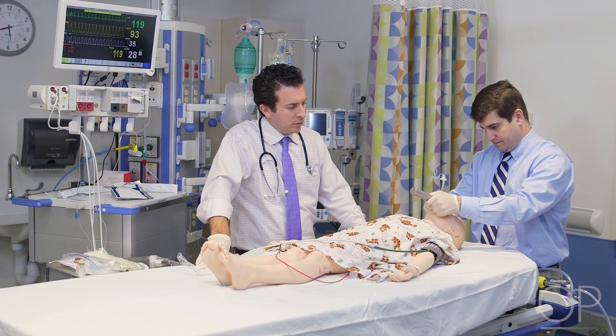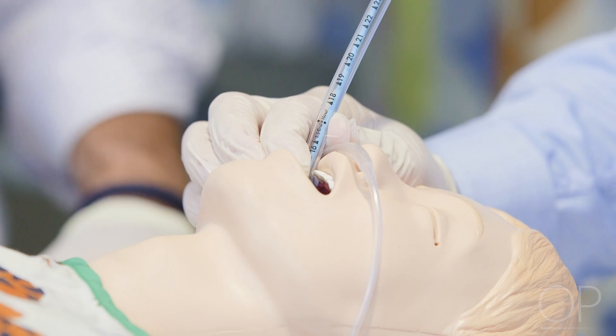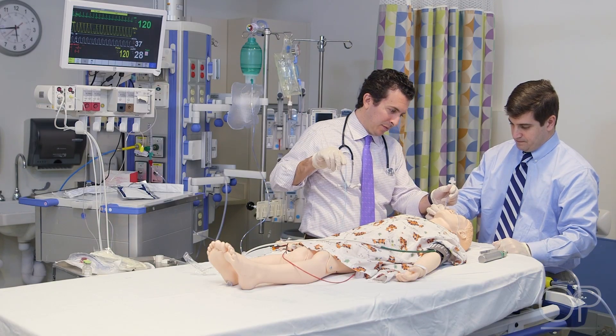The laryngoscope is then removed carefully. The provider performing the intubation uses their fingers to secure the endotracheal tube, commonly by holding it against the hard palate or upper teeth while maintaining part of the hand on the child's cheek to prevent movement. If used, the stylet is removed from the endotracheal tube at this point.